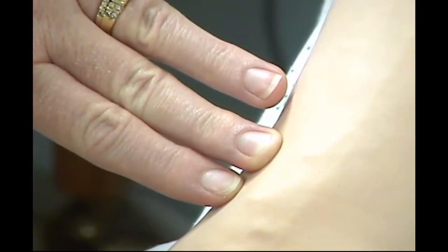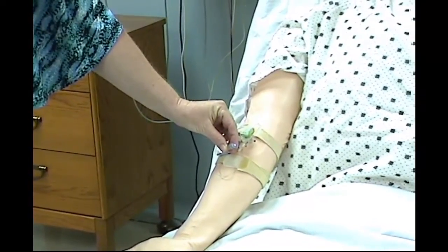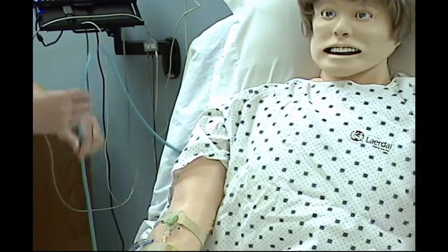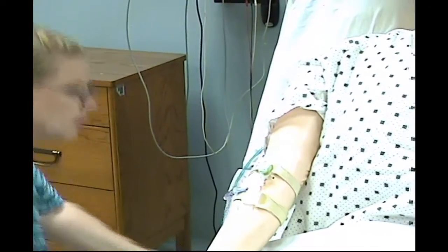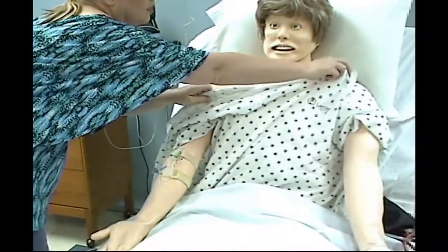The right arm is the IV access arm. You may push IV meds and fluids through this arm. The tube attached to the back of the simulator arm is attached to a collection device under the bed to accept any IV fluids. You'll also notice that the simulator's chest rises and falls with inspiration and expiration.